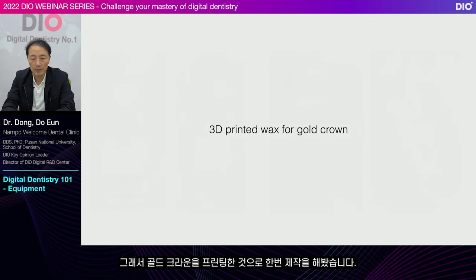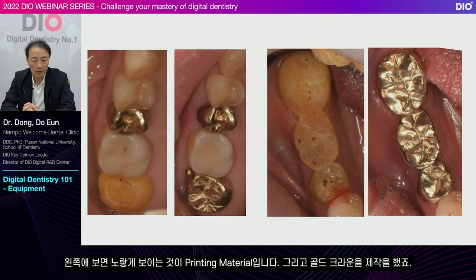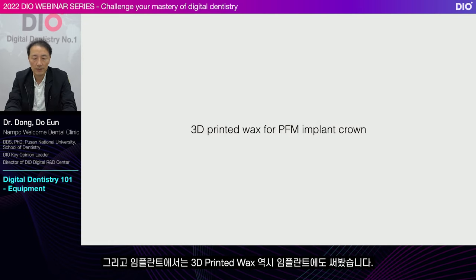So I made a gold crown by printing. On the left, the yellow part is the printing material, and a gold crown was made. I also made the three units on the right side. A gold crown also can be made by scanning. And for implants, I used a 3D printed wax for an implant.